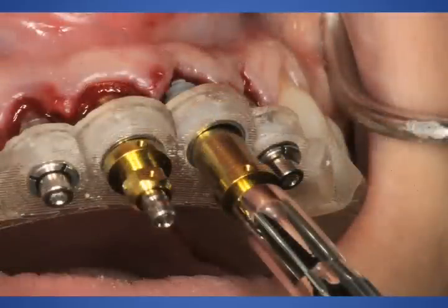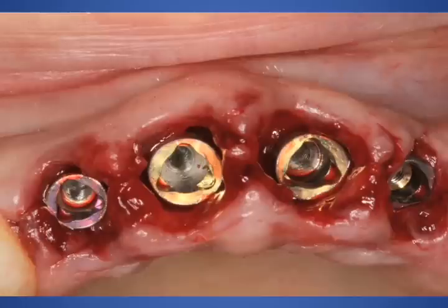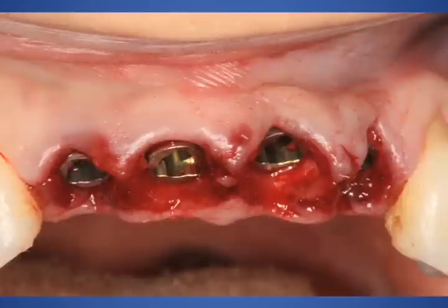And you can see immediately upon removal of those surgical abutments and the surgical guide, the implants are ideally placed based on the CT scan that we had taken and the CT diagnostics that I had created in engineering this case. Interdental papilla is in good position. We're at good bone height.